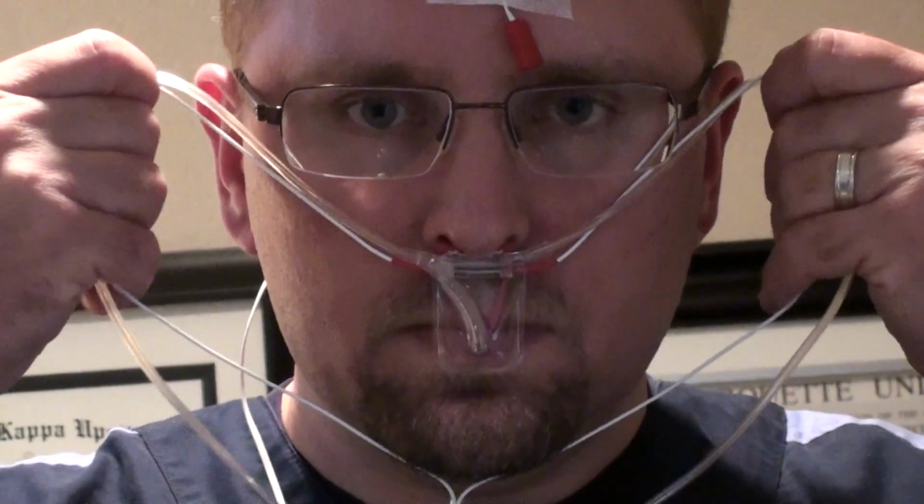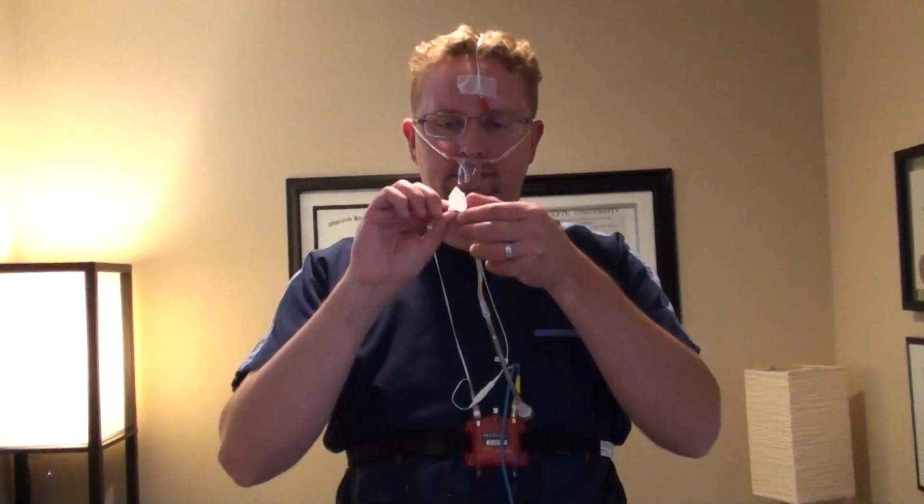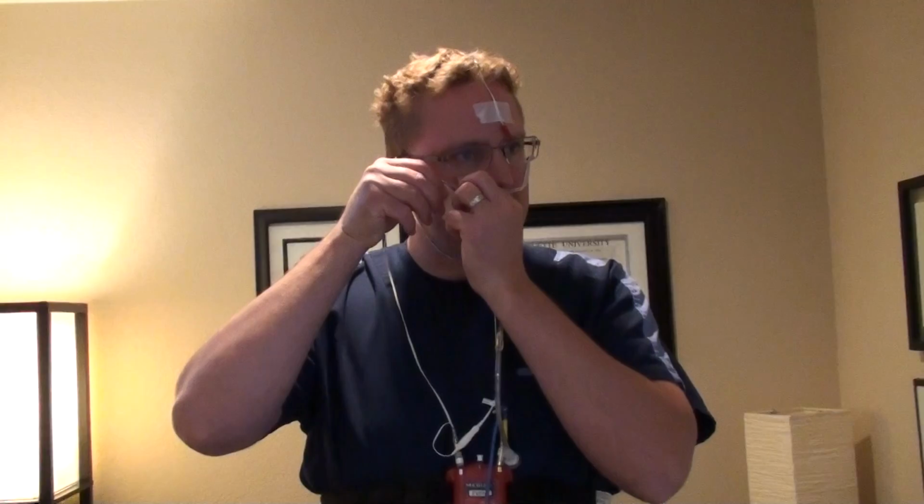Grasp the cannula tubing and C-therm wires in both hands and wrap the tube wires over the ears and under the chin. Adjust the sliders on both the cannula and the C-therm for a comfortable fit under the chin. Place the medical tape on the wires and secure to your cheeks. You may add additional tape to help secure any wires or tubing.